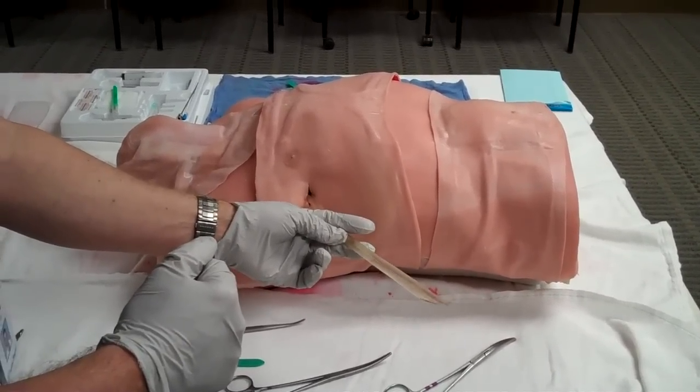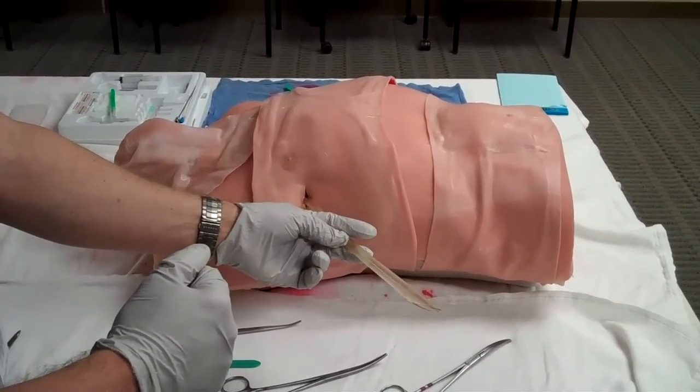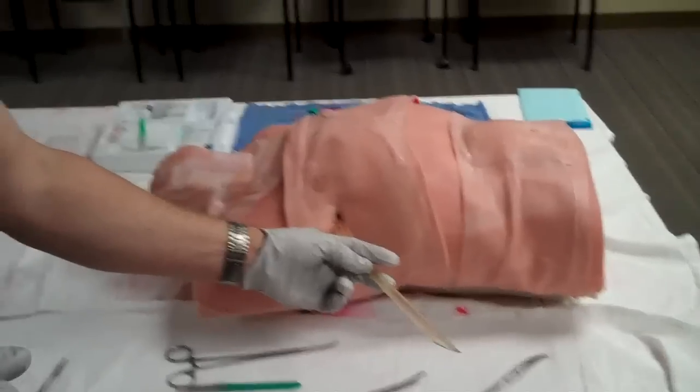Once it is fully secured and you've got a beautiful dressing on it and it's hooked up, you're all finished. So that has been a summary of a proper technique for inserting a chest tube. Remember that it needs to be done quickly and that you need to keep in mind your anatomy as you're doing it, making sure that you're doing it as safely as possible and getting it well into the chest wall.